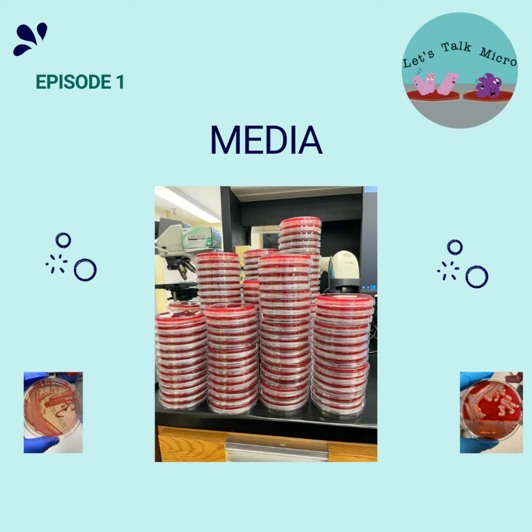Normally, the media is classified based on its functions and what it contains. And here's where we get a little technical. Basically, in bacteriology, we have 4 categories of media. We have enriched media, which has specific nutrients required for certain pathogens. A great example is Lim broth, which we use for the recovery of group B strep. We have nutritive media, which contains nutrients that support growth of most organisms. So basically, it grows pretty much everything.